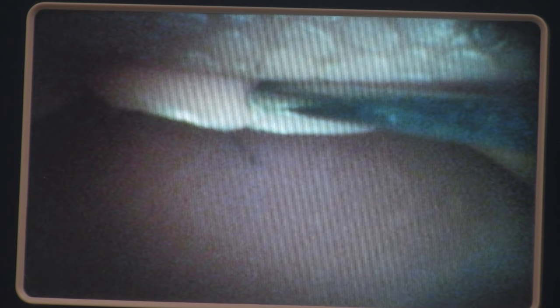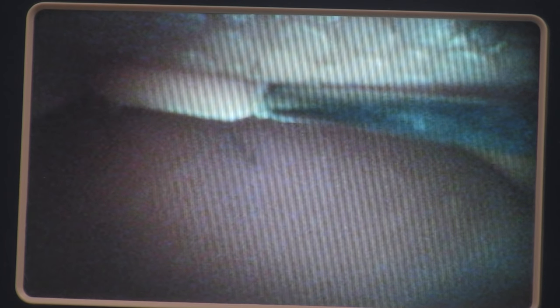Remember, unlike a Macintosh blade, with the GlideScope you're going in midline. With the Macintosh blade, you're going in on the patient's right side and then scooping the tongue out of the way into the patient's left side so you can visualize the glottis.